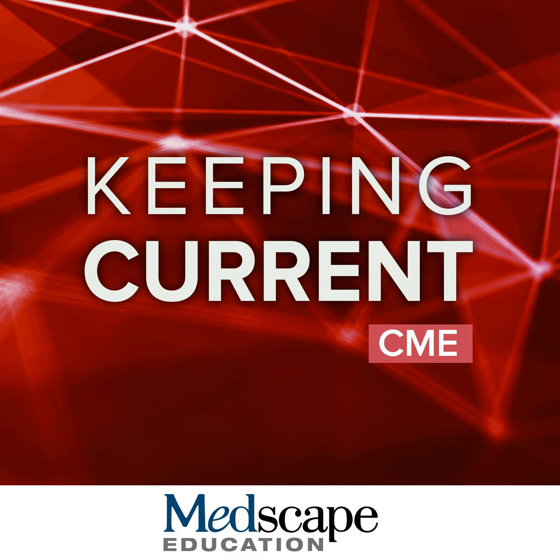There are questions about DTI, diffusion tensor imaging. Do you ever find DTI useful clinically? And if so, in what scenarios would you find it to be really useful or even critical? Yes. So DTI stands for diffusion tensor imaging. It's one of the forms of diffusion weighted imaging where you look at white matter tracts. And so you acquire your diffusion weighted imaging in a certain way to be able to extract this information about the white matter tract.